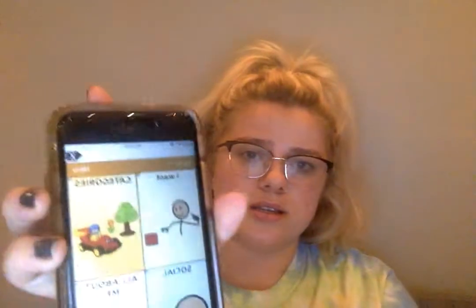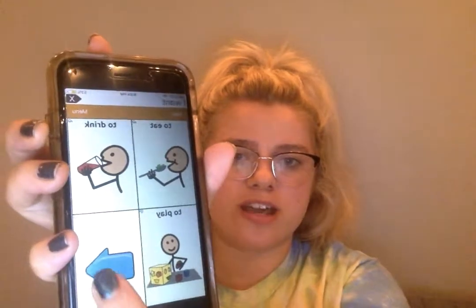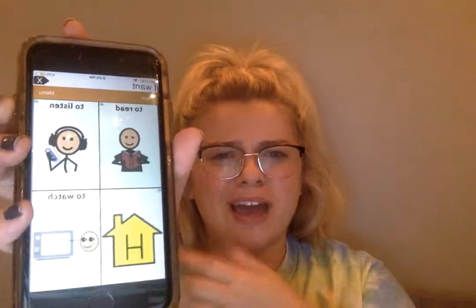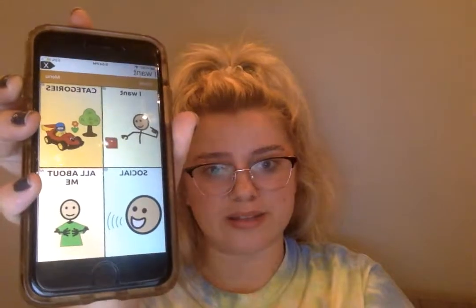I'm pulling it back up again. So it fills it in. I want to play, to eat, to drink. Core words that you might be needing. And if you're like, oh, you know what? I don't know what I wanted to say. I want to go back. There's a home button, and it takes you right back to this main screen, which is pretty cool. So that is the 4-picture page.